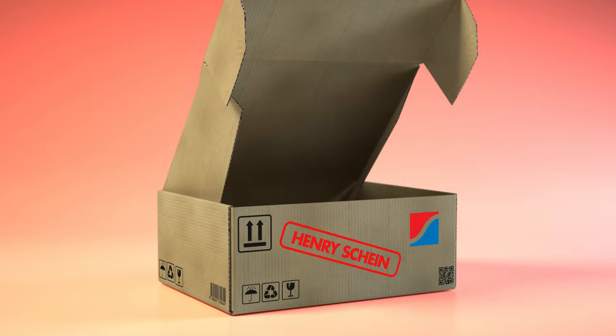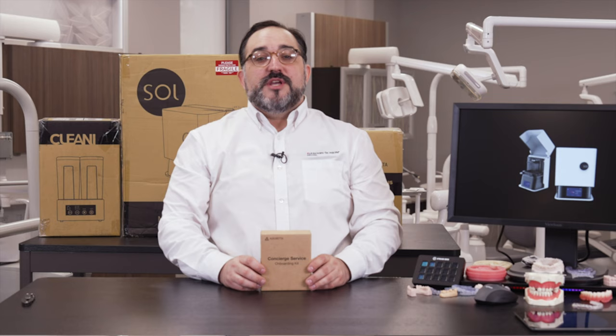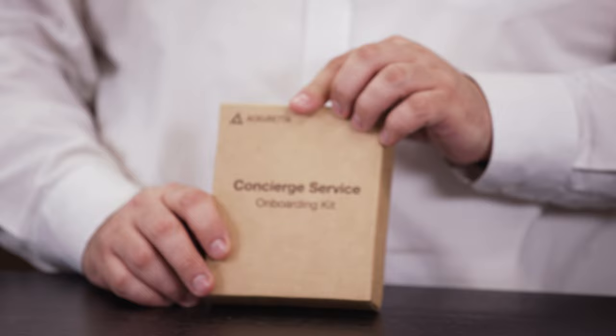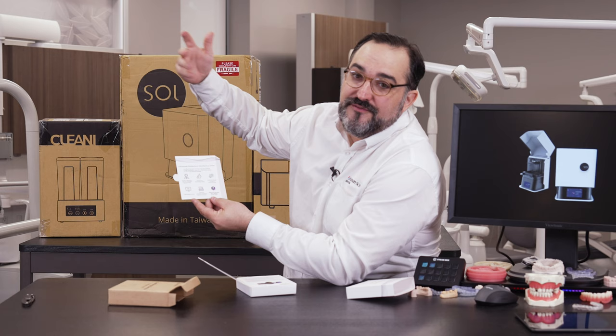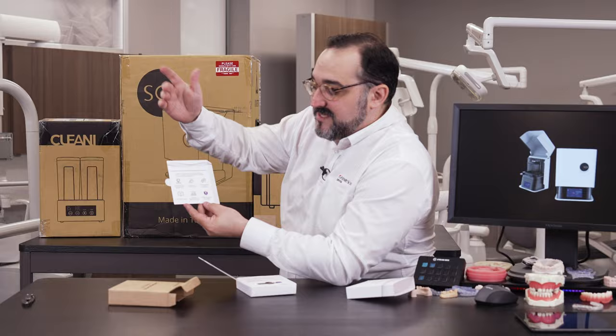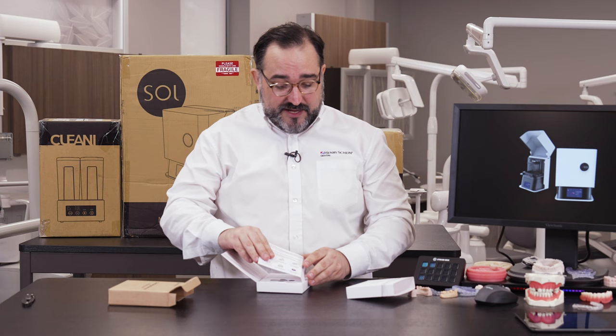Welcome to Henry Schein Unboxed. The first thing we're going to unbox is what Acureta calls the concierge service onboarding kit. It comes with access to priority support, one-on-one 3D printer training, product exchange in case of damage, CAD CAM design training, and access to continuing learning resources — because the 3D printing world is constantly changing. Hats off to Acureta — this is really cool, and here's our software.